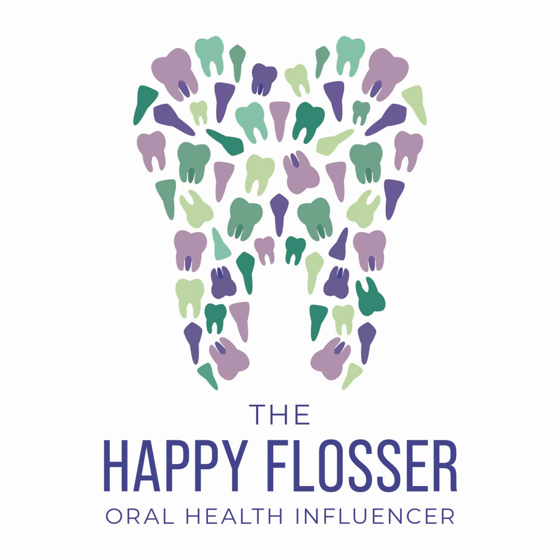So let's talk about how that relates to what the image actually reveals. The more dense something is, the less likely the radiation can penetrate it. So if you picture that you've got your tube head and it's pointed towards the patient's cheek, which is made up of fat and muscle, right? But you have some air in there. So you have air, and then you have the patient's cheek, which is fat and muscle, and there's probably some water in there as well. And then inside the cheek is the bone, which may contain some metal. And then on the inside of the arch is the sensor.